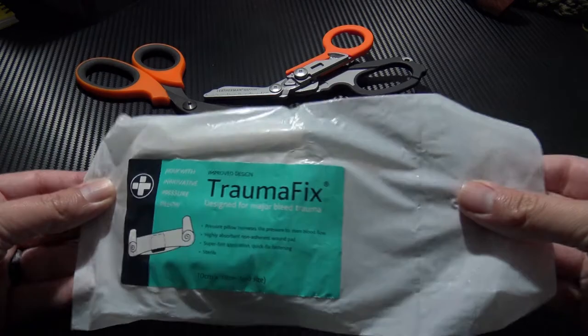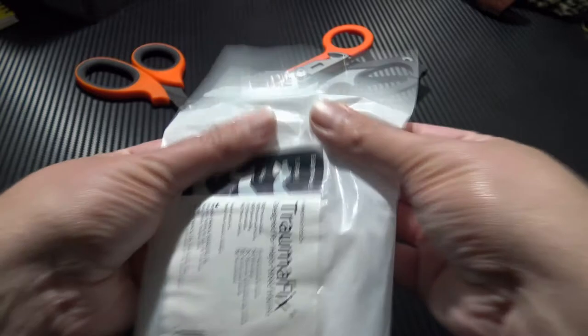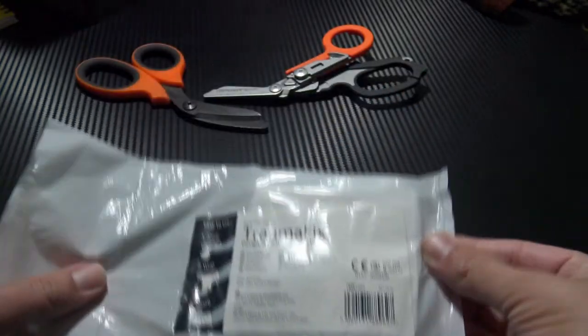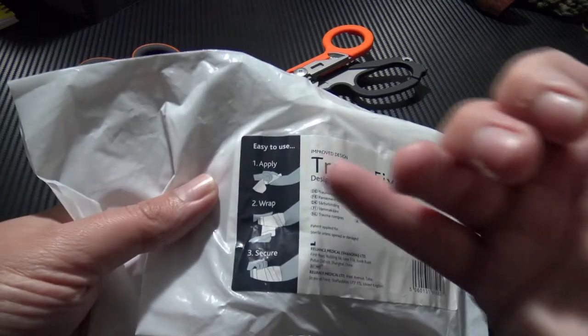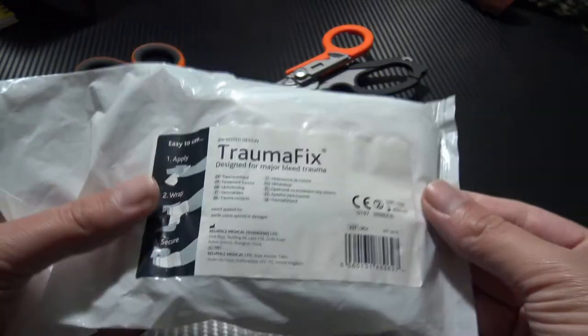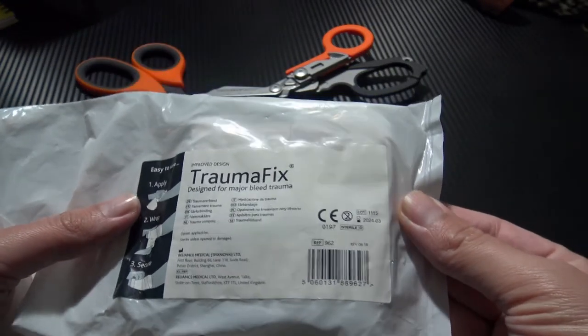This is nice and easy to get into — you can just tear it. This is nice and thin material. On the back you do have some very basic instructions: simply apply, wrap and secure. I'll show you that later.